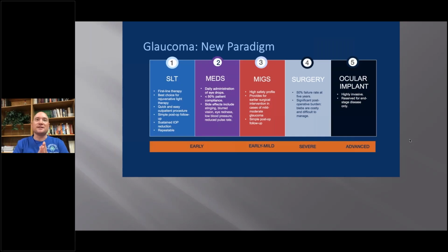You know, that's a good question, and it really goes into it in theory versus what you do practically in the trenches. We didn't have time to cover this, but prostaglandins and SLT have pretty similar mechanisms of action. They both are inflammatory and they both work on outflow. Now, uveal scleral versus trabecular meshwork, but there is some overlap between prostaglandins and SLT. So there is evidence out there, and there are some that believe that prostaglandin success predicts SLT success. Now, you may not want to pair them together because they work so similarly. Maybe you do, maybe you don't, but prostaglandin success predicts SLT success.